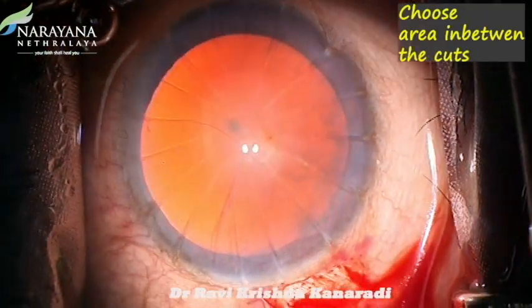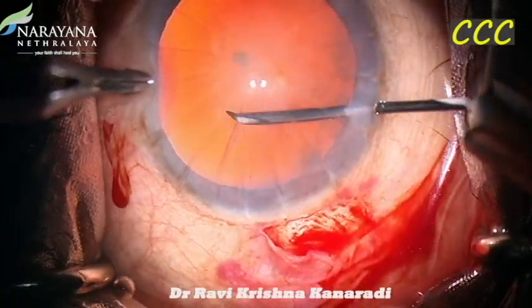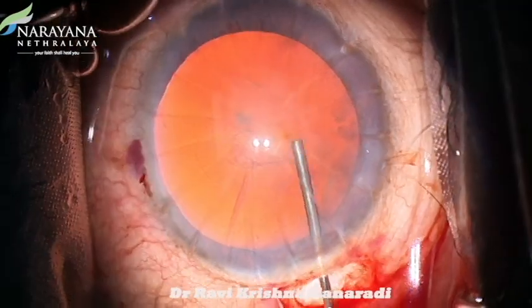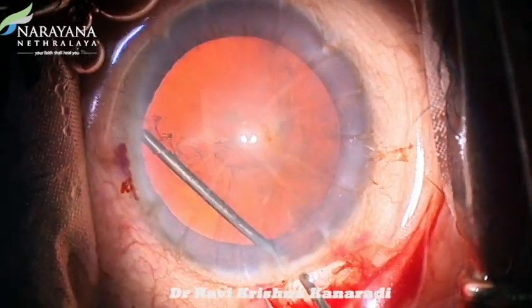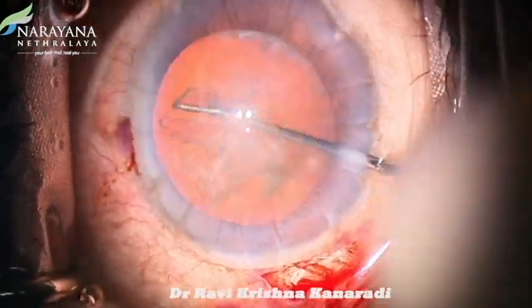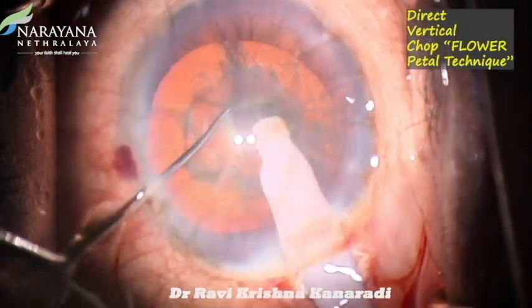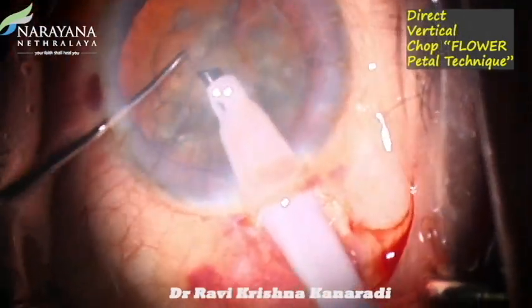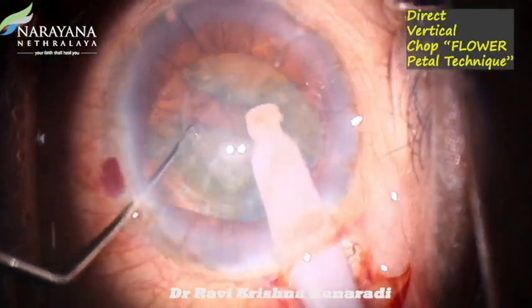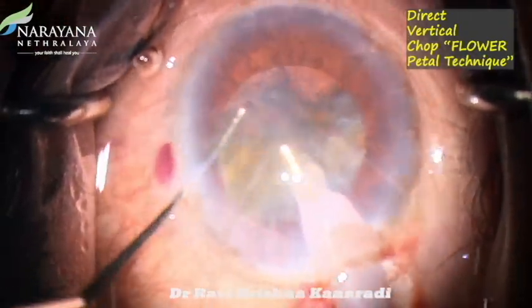Two side ports are made and we specifically choose the clear axis in between the radial cuts. A continuous curvilinear capsulorhexis is performed. Gentle but thorough multi-quadrant hydrodissection is completed. Phacoemulsification is performed under lower parameters and a low bottle height in order to maintain the integrity of the cornea. Here we have used the direct vertical chop flower petal technique for optimal results.